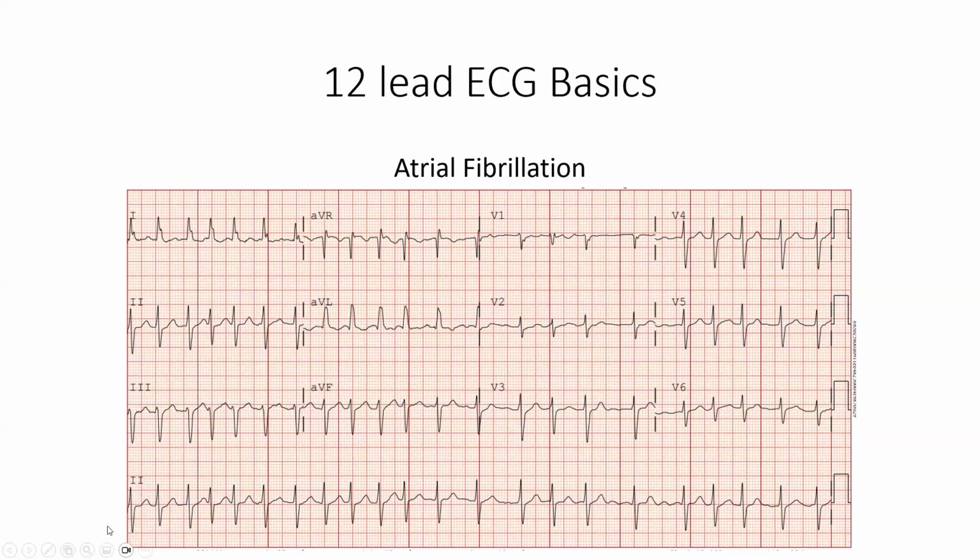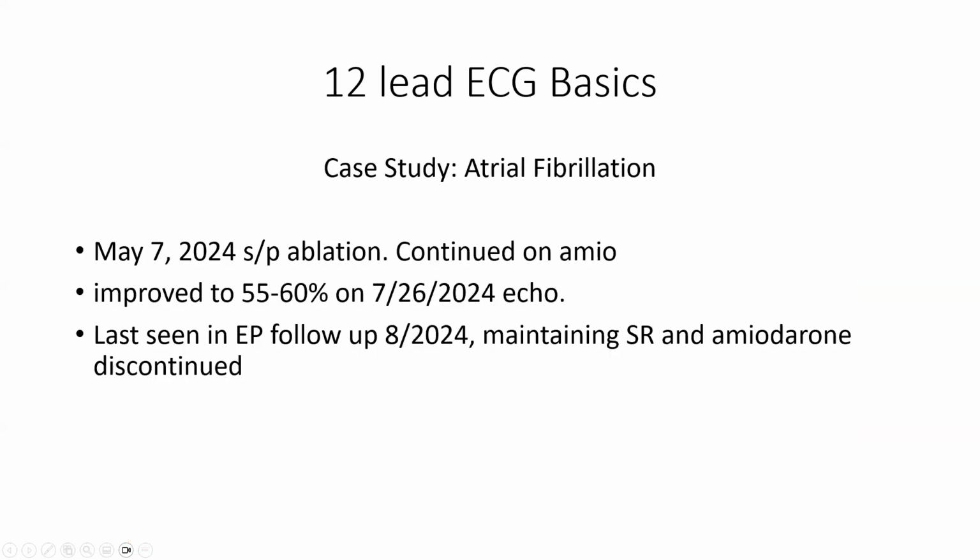And here's his 12-lead EKG. Rates are about 150, and there's an irregular R to R with no clear P waves. And so he is now doing well post-ablation, and with rhythm control, his ejection fraction normalized.